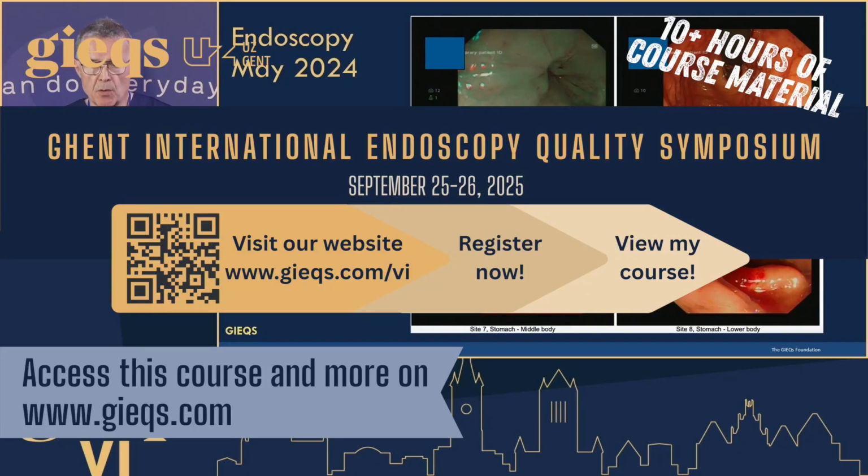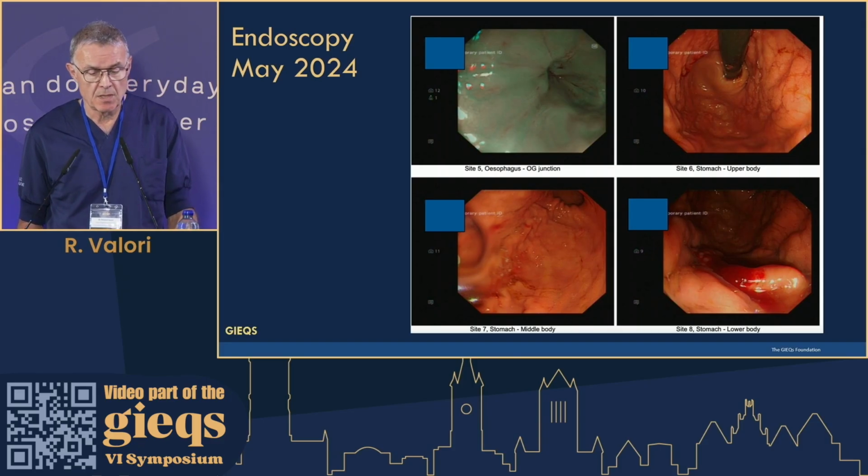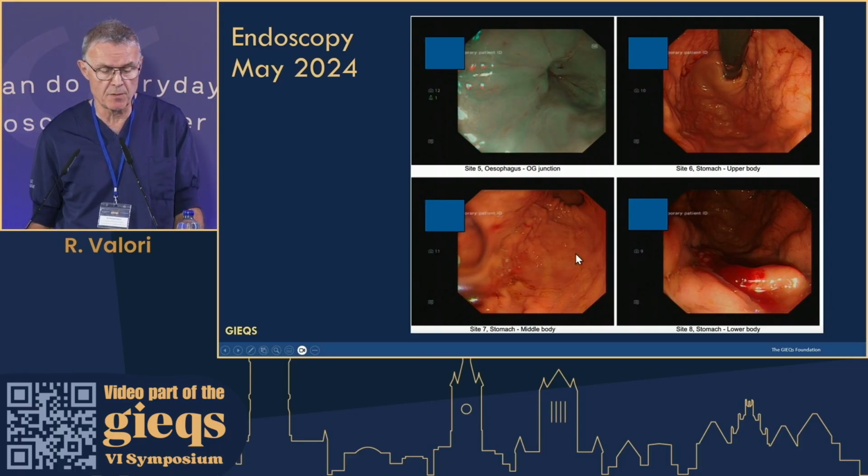Now, I'd be interested to know whether my colleagues on the panel think these images are satisfactory or not. They don't look great, do they? There's a couple of things. There's a bit of blurring here from some fluid. This is out of focus. This image, who knows what's going on there?